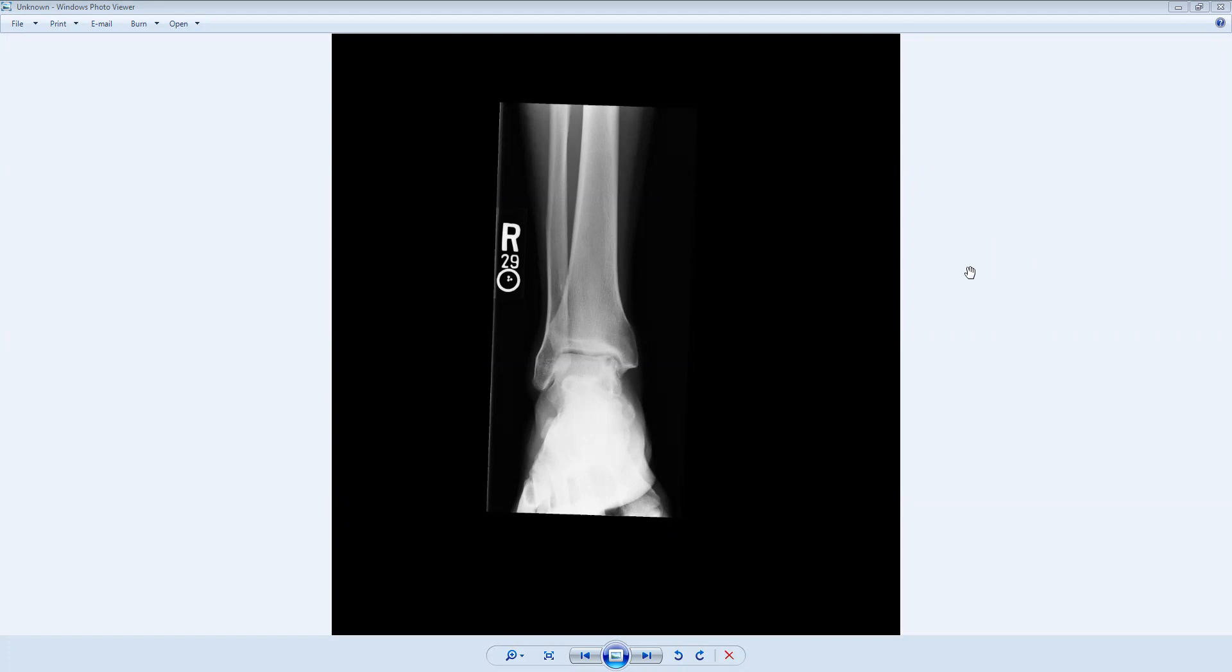Typically, we get three views: an AP, an oblique, and a lateral view. Here we're seeing an AP view, an anterior-posterior view of the right ankle.